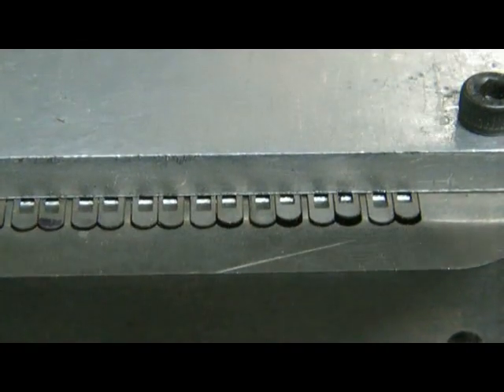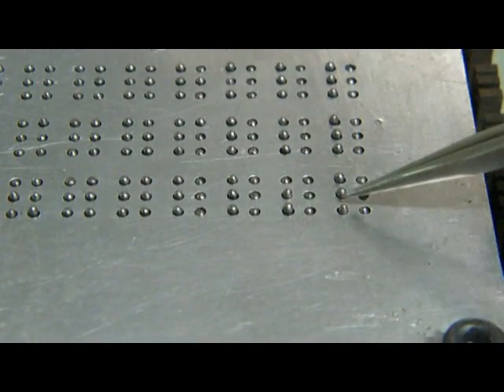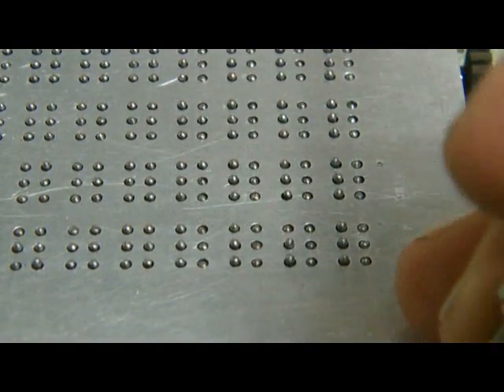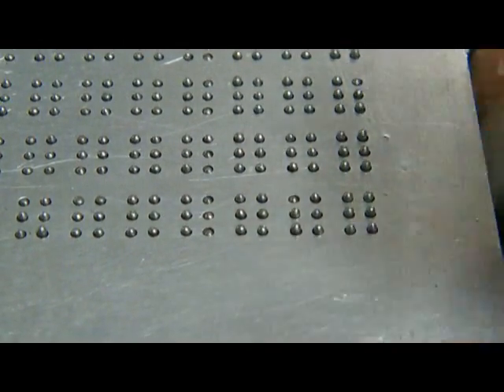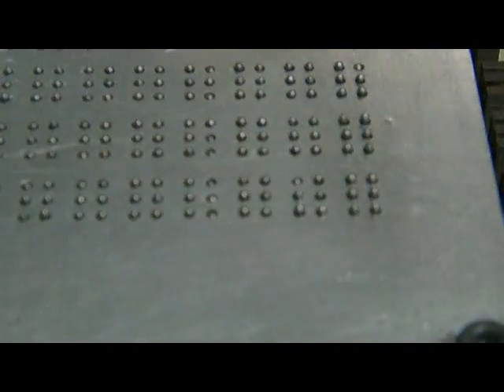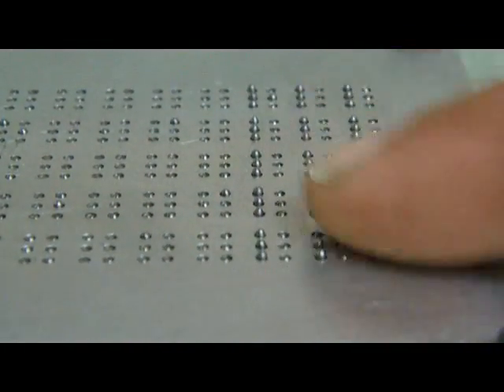Now the pins that are already raised, I can latch them shut in the raised position. For instance, the second set of pins over here in the second column, they are open, but I can latch them in the open condition so that they don't fall. And we'll unlatch the pins in the first columns. So I've latched basically now the second column of the first cell, and I'll latch the second column of the second cell and the second column of the third cell. So in whatever position the pins were at the time of latching, they'll remain in that position. I think you can see the entire second column was latched with the pins in the raised position. All the rest of the pins have dropped.